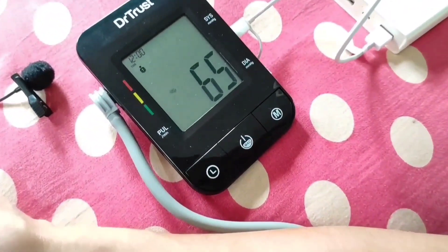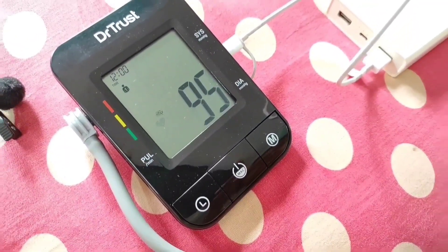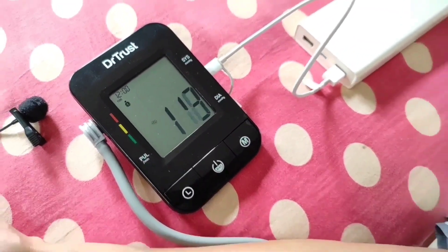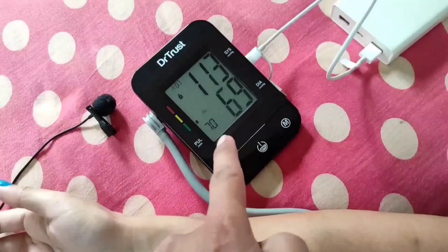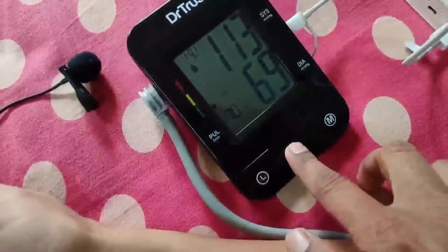You can see the increasing pressure in the cuff — 78, 83, 89 — and the flashing heart symbol on the monitor shows it is detecting your heartbeat. The reading shows 113 as the systolic pressure, 69 as the diastolic pressure, and 70 as the pulse rate.